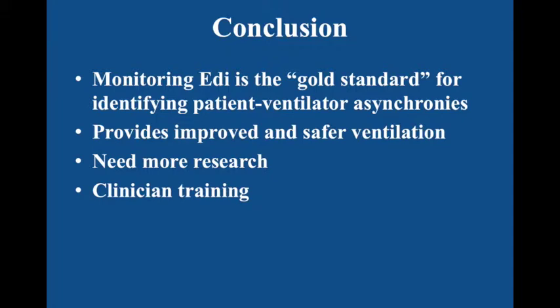Clinical training is not only for the RT, but also for nurses, physicians, and any other clinicians. NAVA is a new mode. When we want to use it on a patient, we should pay more attention, get more study, and then put it on the patient. Try our best to put it on the patient.